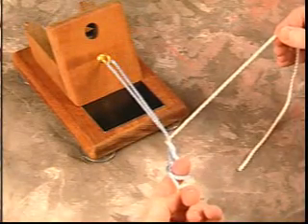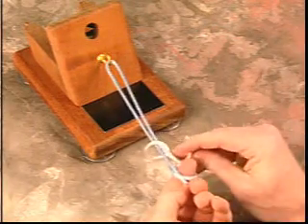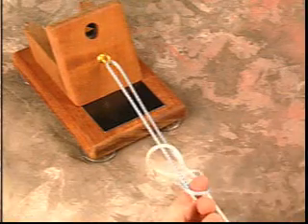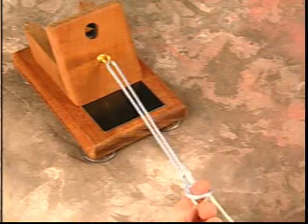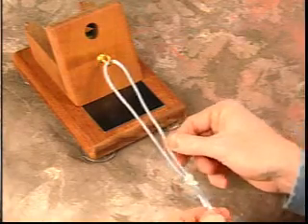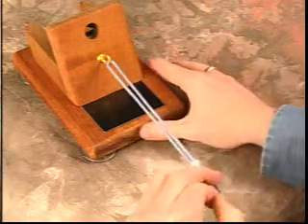A subsequent second throw is made around each suture. You then bring the end of the loop limb through the loop made by the first throw, around where your index finger is.